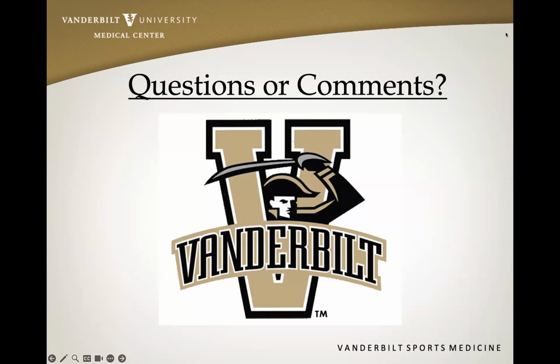And then the other thing I've seen, which I hadn't before, and I was actually referred for a similar indication recently, maybe several months ago, was someone that had almost like an iliopsoas sort of snapping, where the muscle interposed between the second dorsal compartment tendons in the wrist. And then when they went to, I can't remember if it was extend or flex, the tendons wanted to drop back down to the bone and it snapped the muscle out. And so just being able to look at a variety of different things and asking the patient how they can reproduce their symptoms is really helpful.